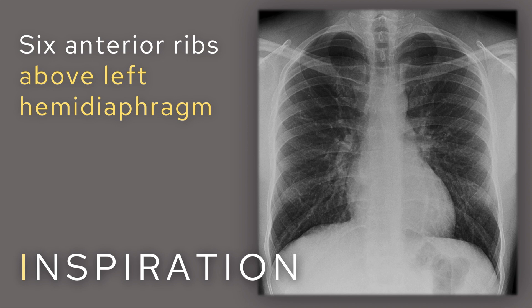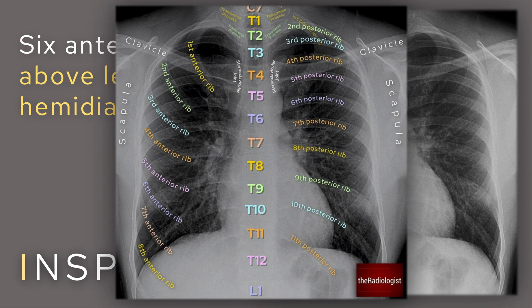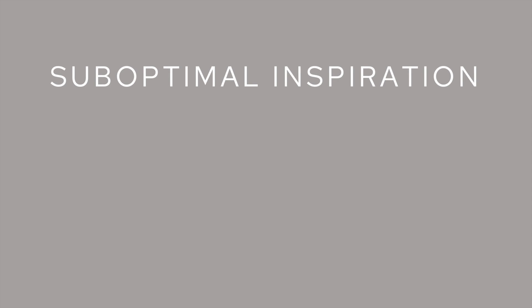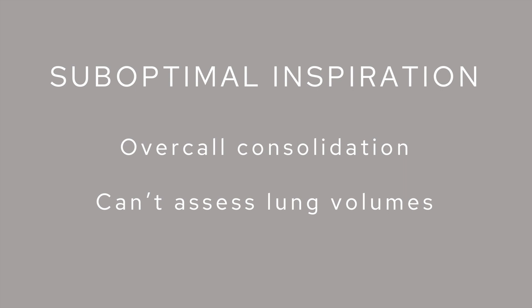Moving on to I for inspiration. The way I do it is to look for six anterior ribs above the left hemidiaphragm. The posterior ribs are the ones you can see more clearly and are more horizontal; the anterior ribs are more vertical. Count one to six anterior ribs and make sure you can see those above the hemidiaphragm. If you can, you have adequate inspiration. With suboptimal inspiration, the lung vessels will be crowded together and appear brighter, so you may over-call an opacity. It can also be difficult to distinguish poor inspiration from the patient genuinely having reduced lung volumes.